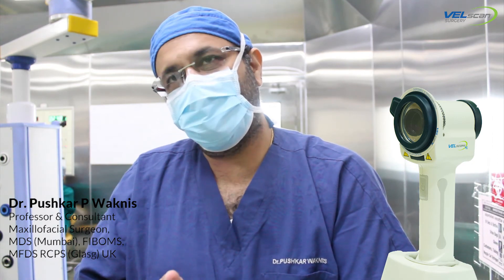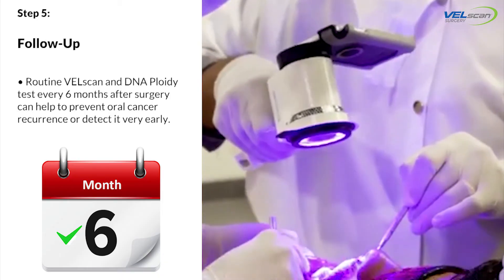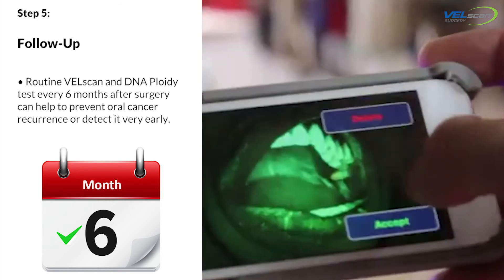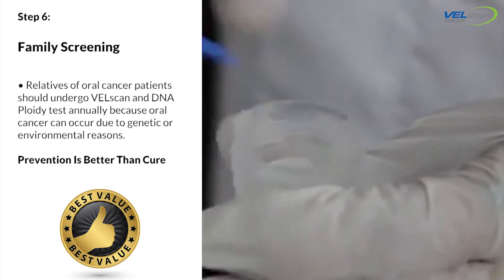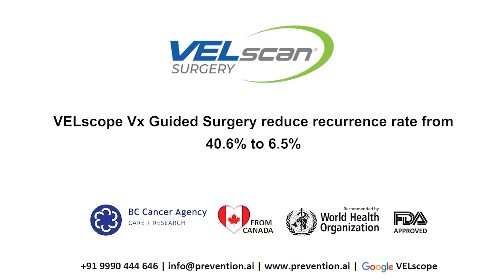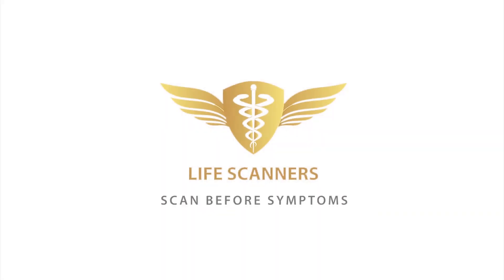Not only that, the deep surface of the cancer is where recurrence can occur. When you remove it, you can take the deep surface and see it with the well scan. If everything looks green, it means the tumour is not there.